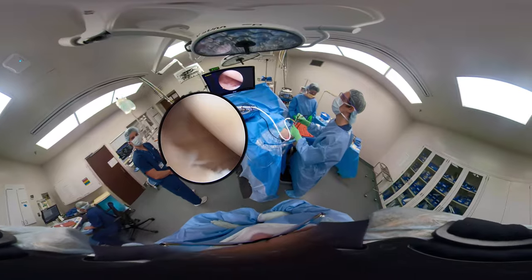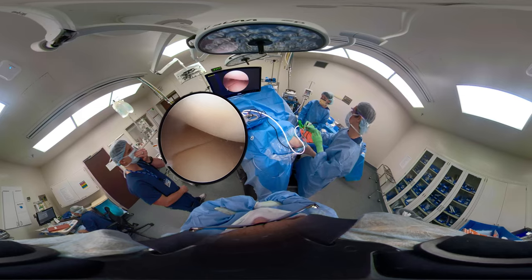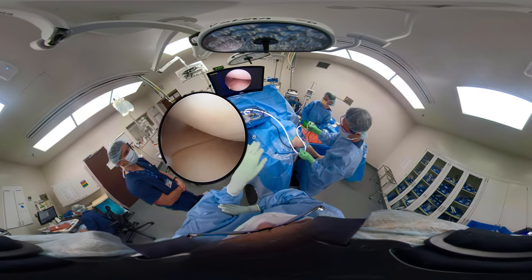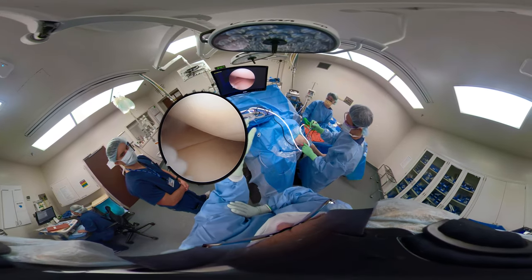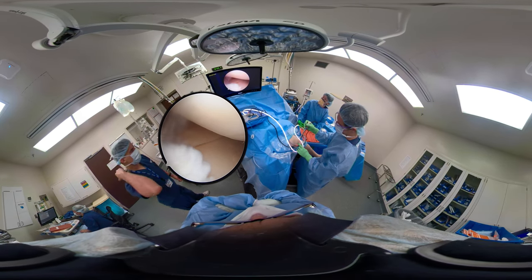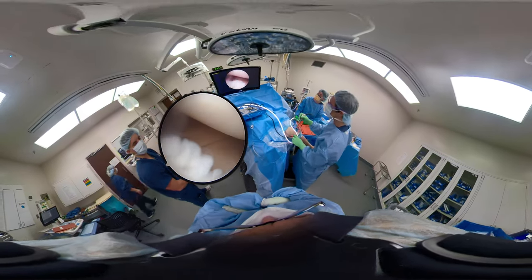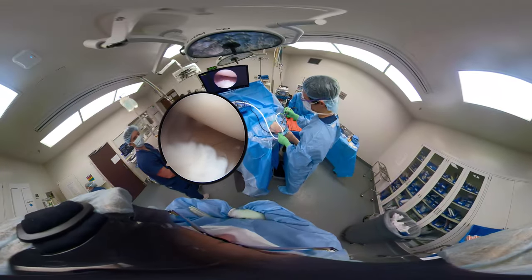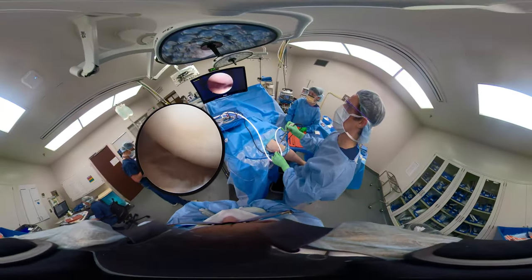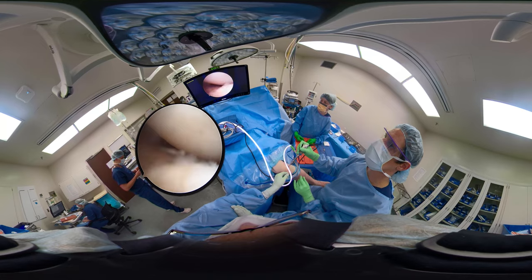The fat pad is in the lower left and we'll come in with a needle directly over the anterior horn of the medial meniscus. I like using horizontal incisions so that I don't injure the medial meniscus. You can see the light shining on that medial side — he can push on it with his finger to triangulate to get that medial working portal in the correct spot. If you're going to do work back to the posterior horn of the medial meniscus, you need to be just above the medial meniscus, hugging it. The needle is through the fat pad, so we'll go just posterior to that for our incision, or our mini arthrotomy.